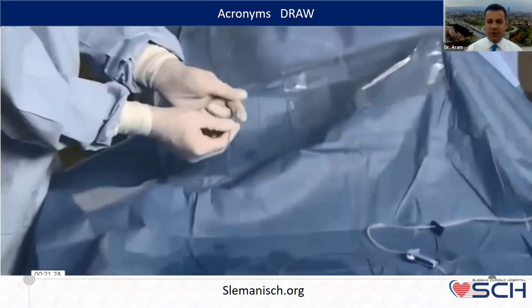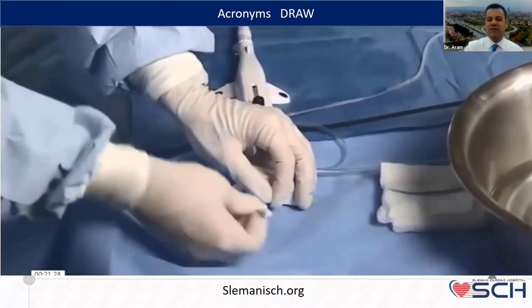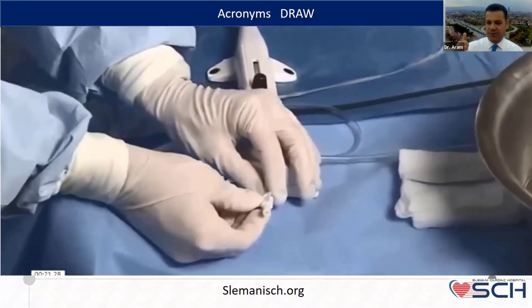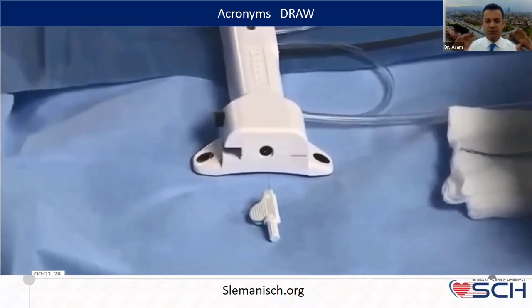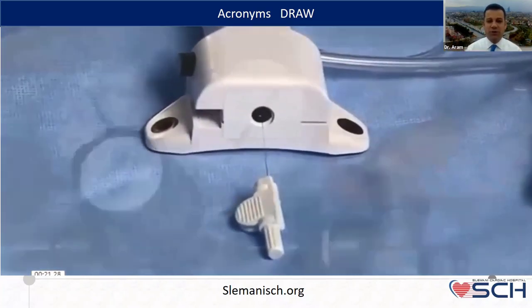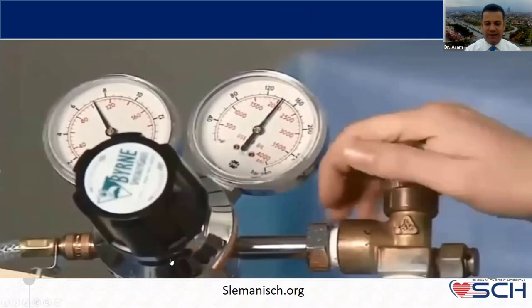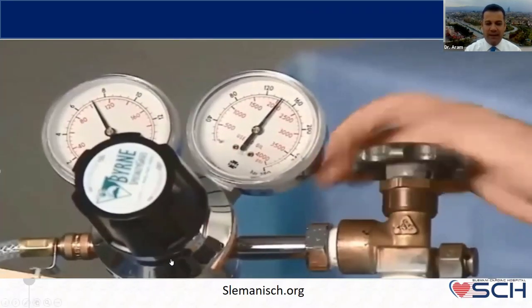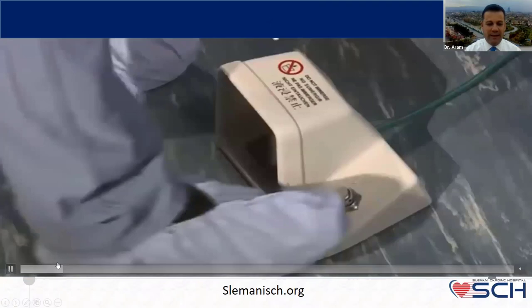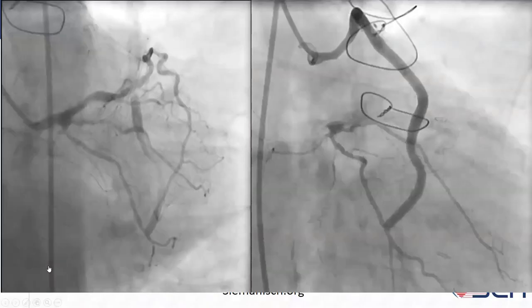In rotation, we should make the rotation between 160,000 and 180,000. All the time, we are going to keep it between 160,000 and 180,000, unless the rotation will not be too much to make the rotation in the perfect way.